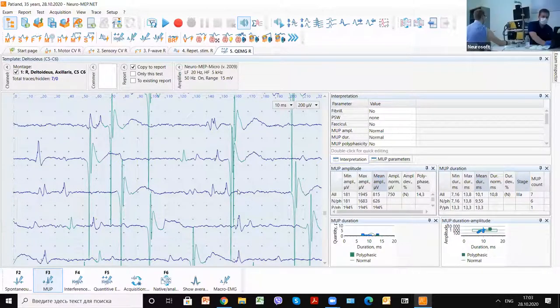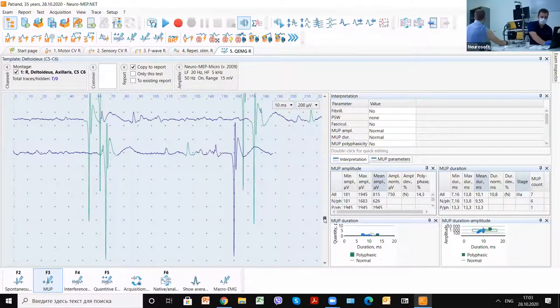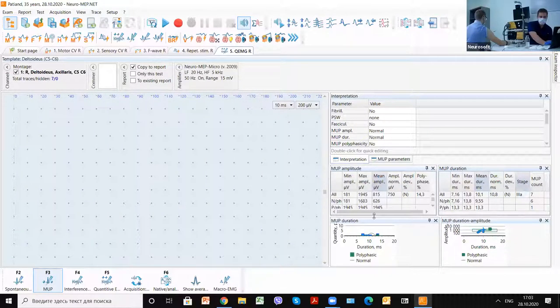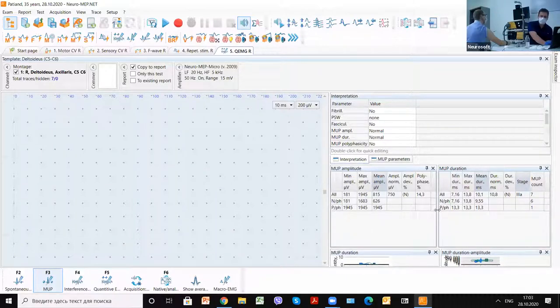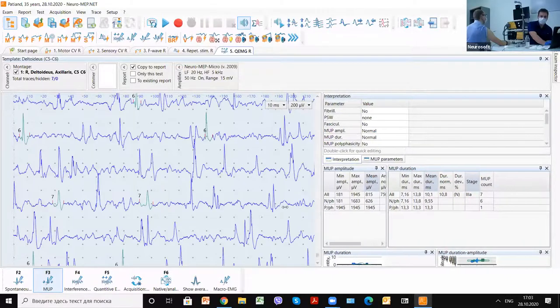Because they are very unstable, we can find additional motor unit potentials. But now all parameters, especially amplitude and durations, are absolutely normal.